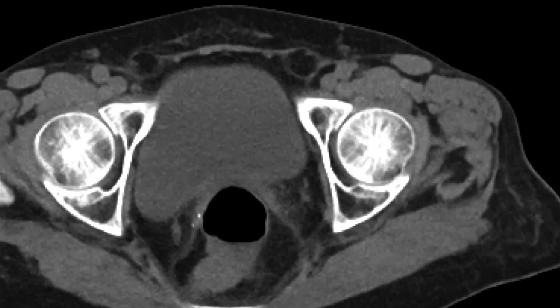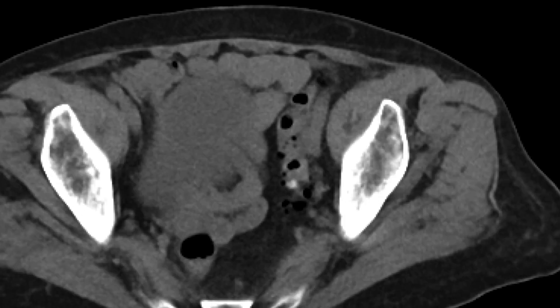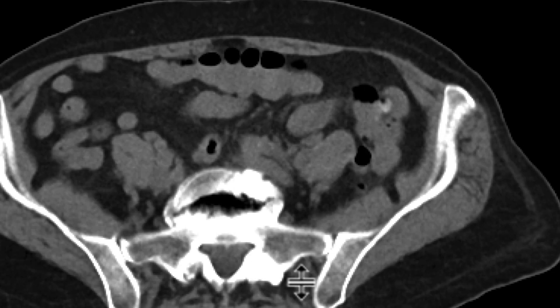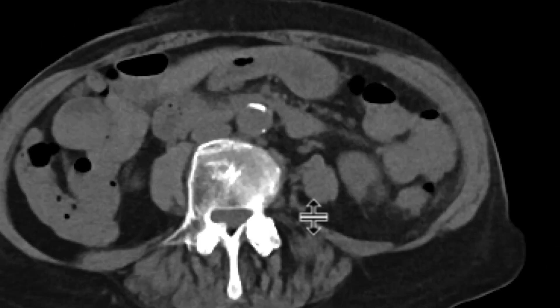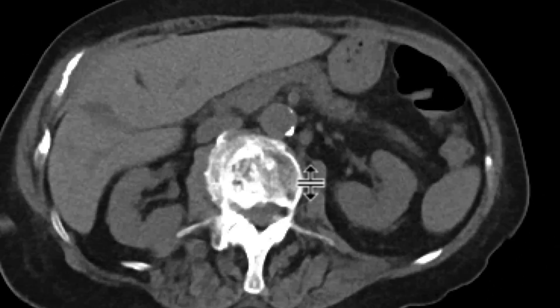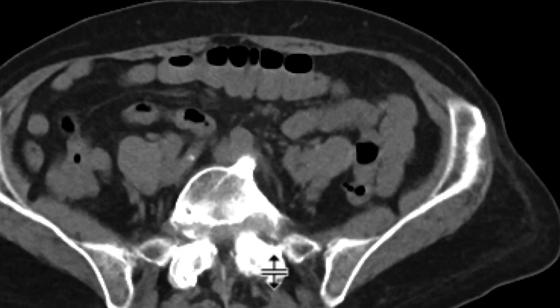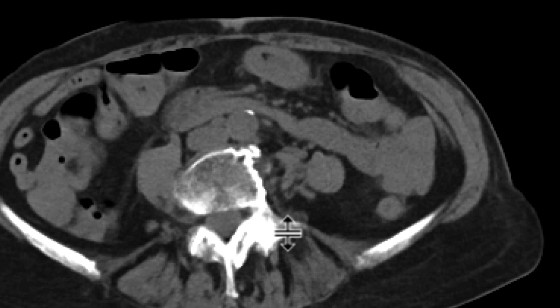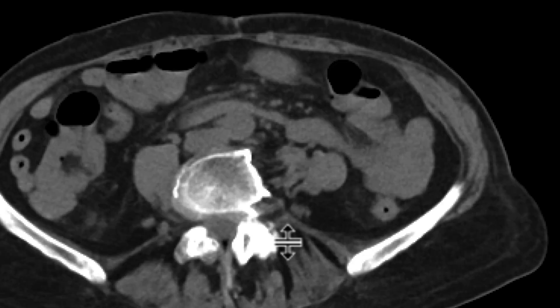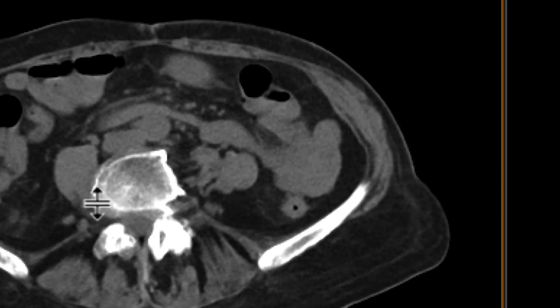There are a few diverticulae which have some high density, probably from some prior barium, but overall it looks pretty good. I want you to focus on the ileocecal valve — we can see a fatty portion of it right over there.